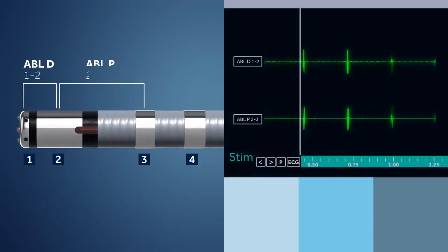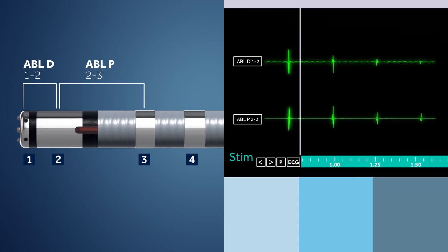The EP recording system can be configured to display electrograms from the distal and proximal electrodes, allowing for precise ablation guidance.